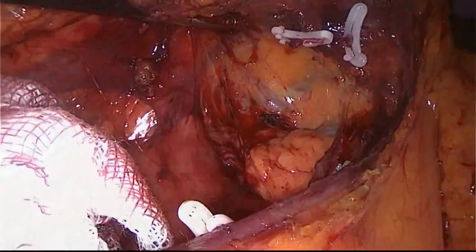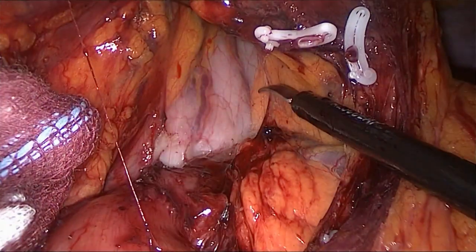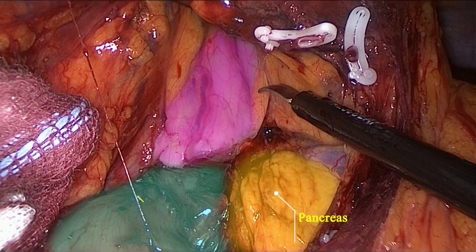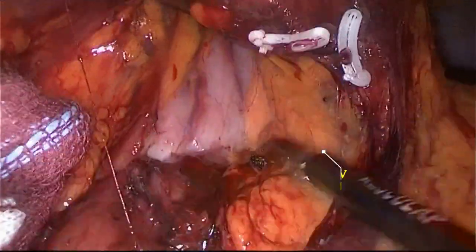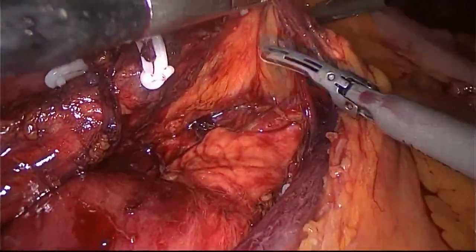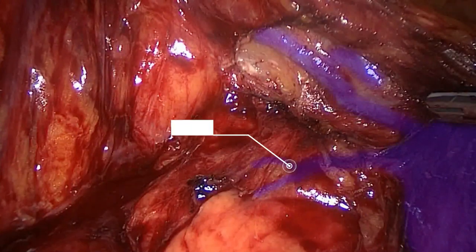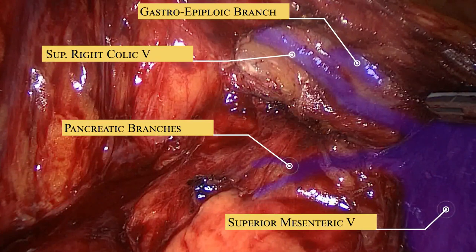The dissection eventually takes us to the lesser sac, where the posterior part of the stomach is identified. As we carry our dissection cephalad, the Henle's trunk anatomy is identified, which is often a place of vast anatomic variation. In this case, it consists of two pancreatic branches, the gastroepiploic vein — which is the only one always present — and the right superior colic vein.